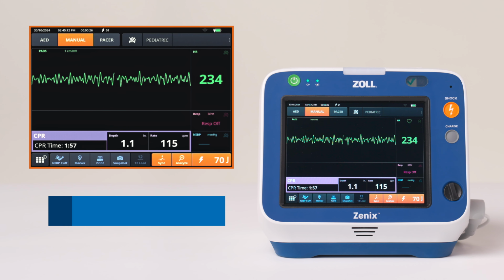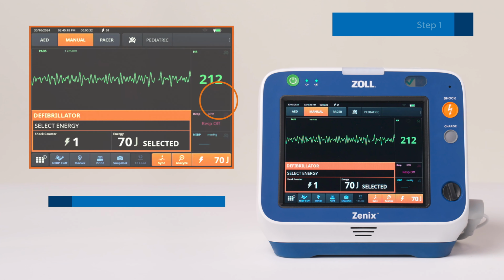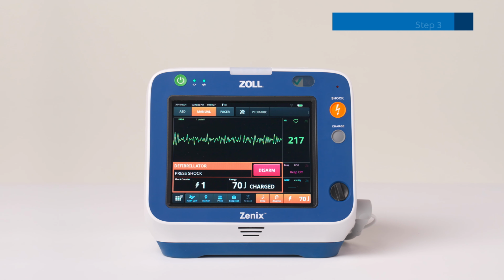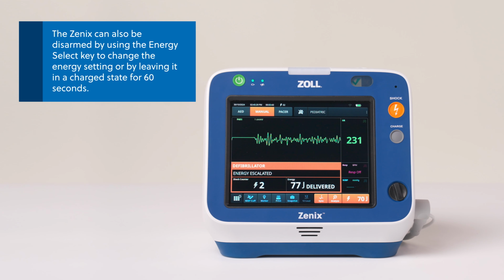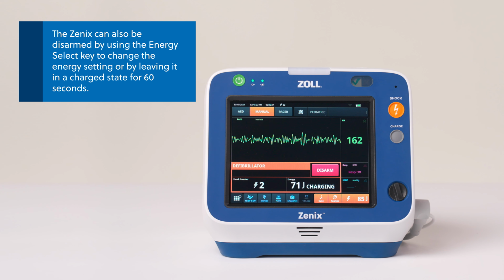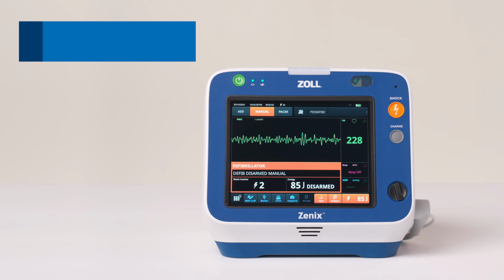Manual defibrillation is a 3-step process. First, confirm Energy Select Joules. Next, press the Charge button. Finally, deliver the shock. To disarm the Zenix defibrillator monitor at any time once it has been charged, select the red Disarm key located on the right side of the defibrillation dashboard.